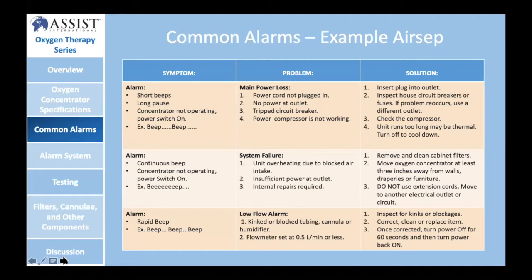And another thing that you want to consider is the use of extension cords. We have seen the widespread use of inappropriate extension cords in medical facilities in low and middle income countries. In most Western contexts, there are medical grade extension power cords that are utilized that can handle the kind of energy draw that is needed to sustain multiple medical devices. But we've seen many times just the use of cheap extension cords in hospitals, and this can be very dangerous.